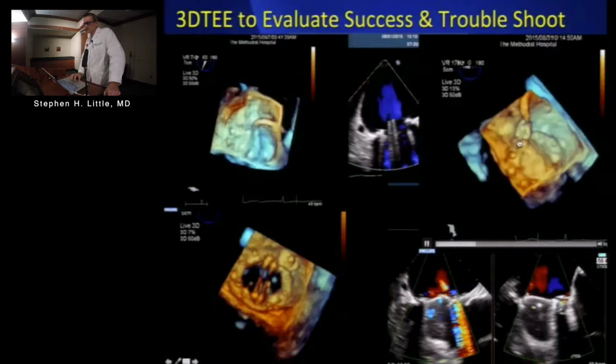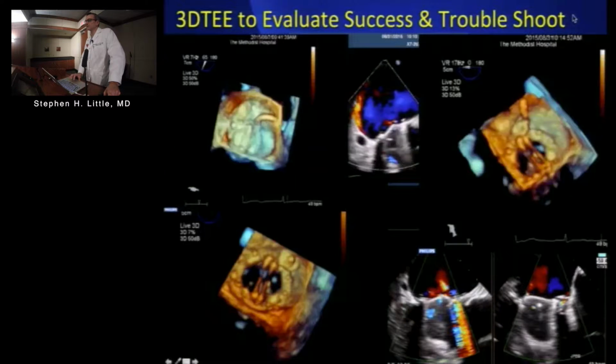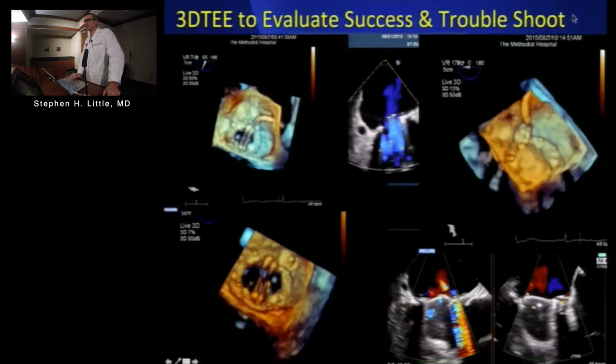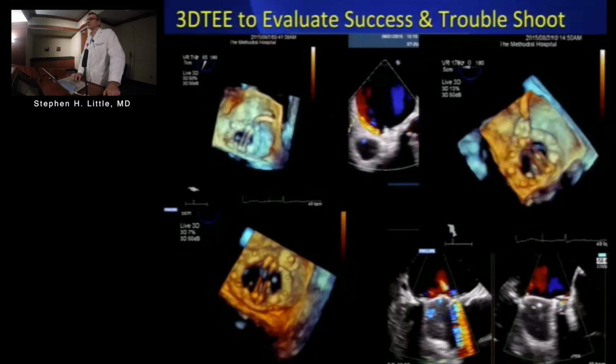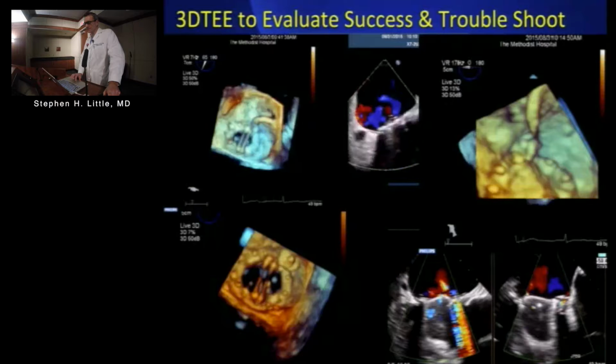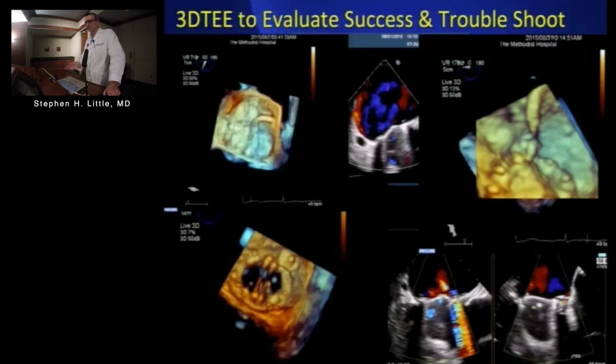But if we look closely, we had this deployment. We still had a little too much color. We sort of said, well, we're probably going to have to put in a second plug, which we sometimes do. But we just said, let's look closely. Let's look really closely. Let's zoom in, even within 3D. And when you zoom in, you can see that, in fact, the edge of the device is sort of lifted up.